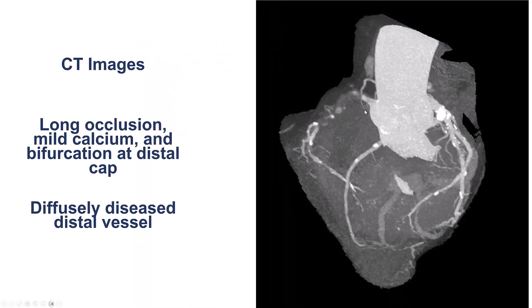This is the coronary CT angiogram showing the blunt proximal cap. There is some calcification but not much within the occluded segment. This is a long occlusion and the distal cap is at the bifurcation of the distal RCA and the acute marginal branch.